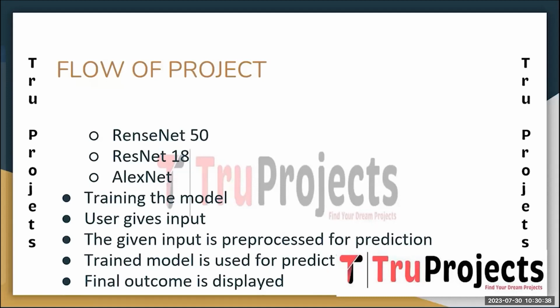And the next step is the trained model is used for prediction. The pre-processed user input is then fed into the trained deep learning model. The model processes the input and predicts the presence of neovascularization in the fundus image.